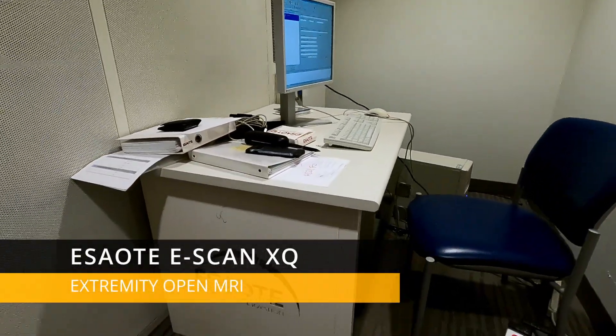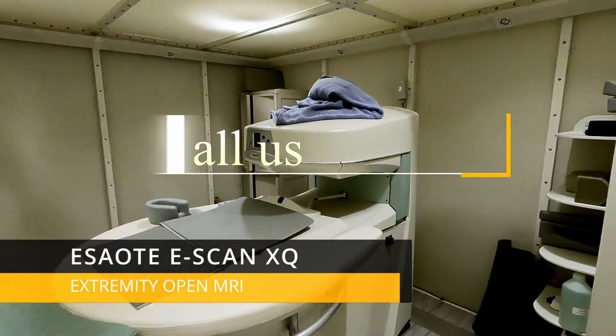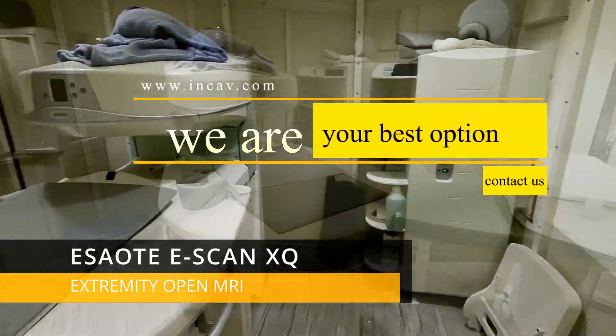Welcome to INCAV Medical, continuing with our series of videos for the medical community. Today we are going to see the open MRI, the Esaote E-Scan XQ. Also, we will do a full knee study.